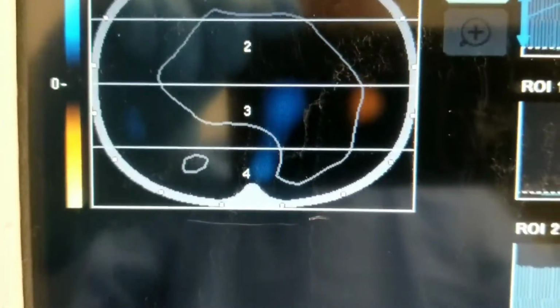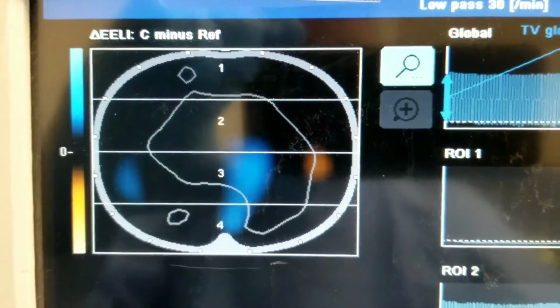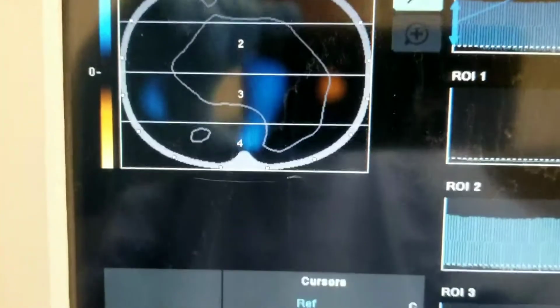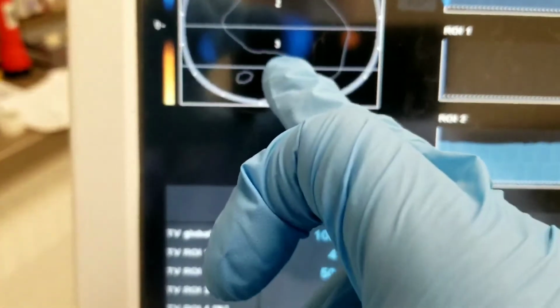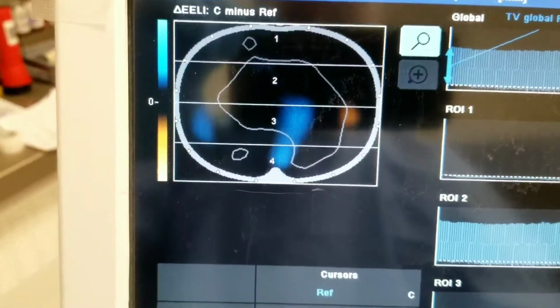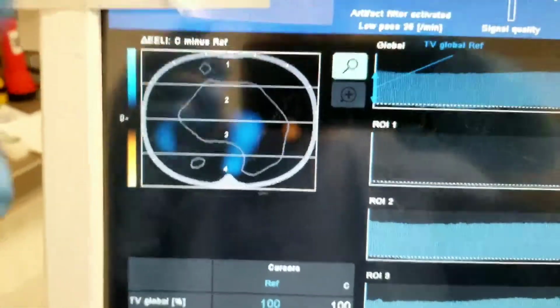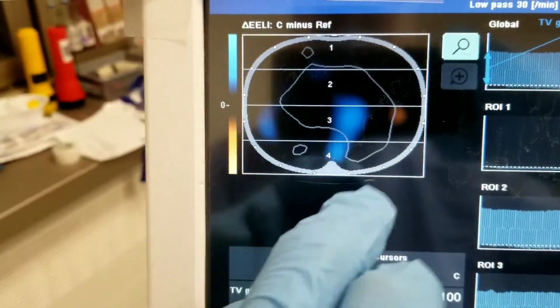So this is going to tell you, due to the changes, where are you gaining and where are you losing? So we're actually gaining at an important gravity-dependent area. We reduced the Phigh, we reduced the pressure, and we're actually getting better distribution here, which often can indicate over distension, right? We went down low, maybe we were too up there, and then the lung was kind of overinflated, and that reduced the compliance, and the lung was a bit overstretched. So now that we reduced it, we're actually gaining a lot of blue, and that's a good thing.